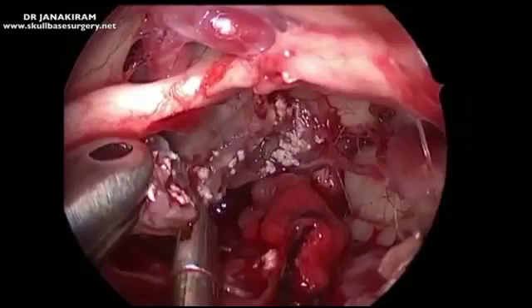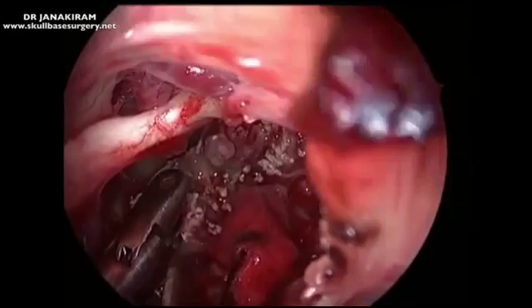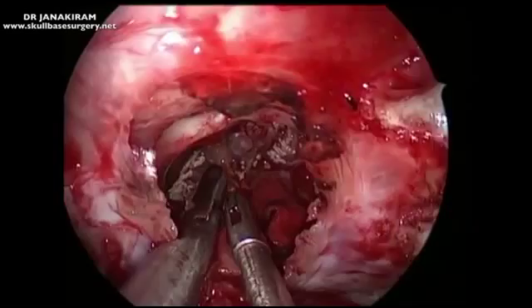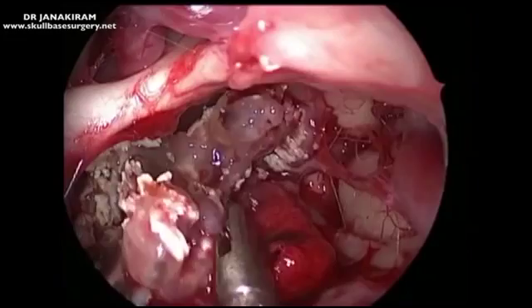We decided to leave behind a small residue over the base of the thalamus — we didn't want to create problems. We decided to go in for a sort of near-total excision followed by gamma knife. More than 95% of the tumor has already been removed.